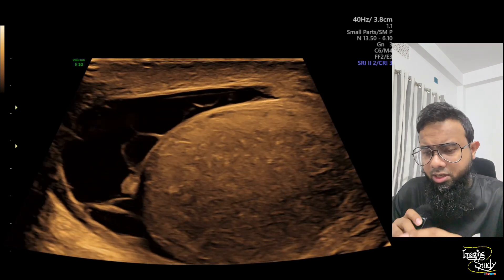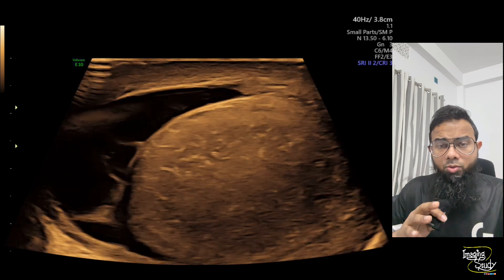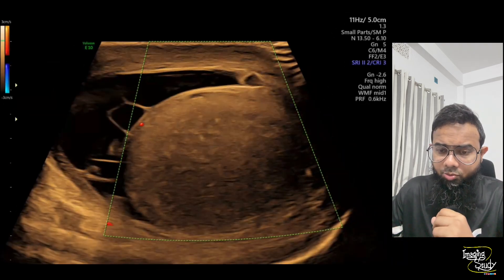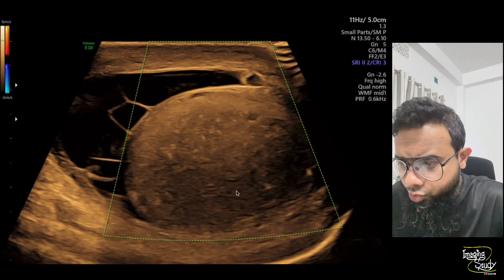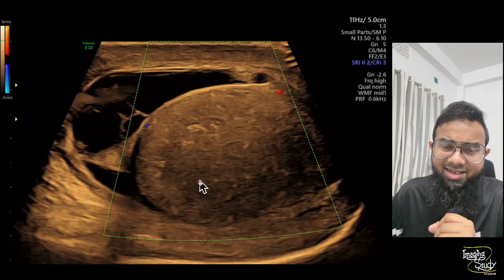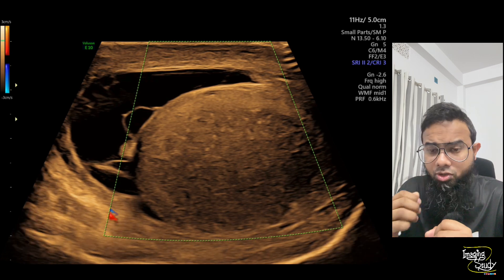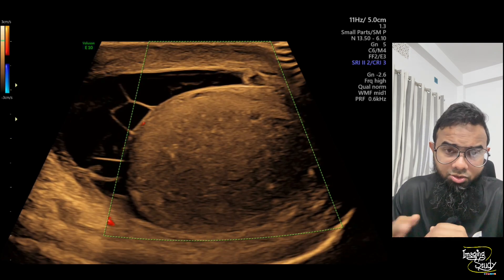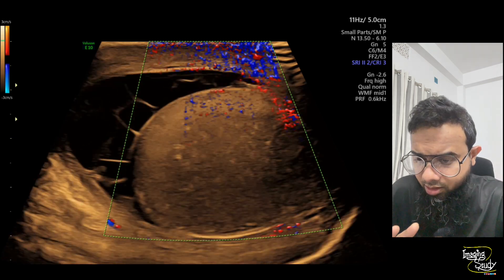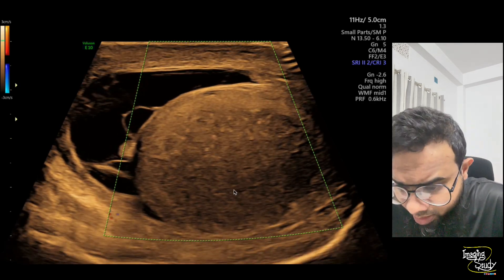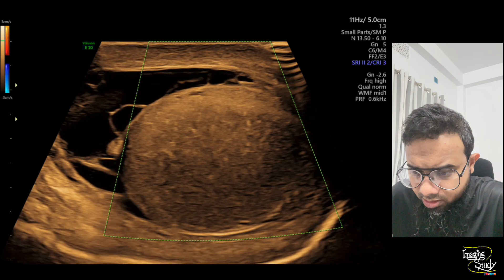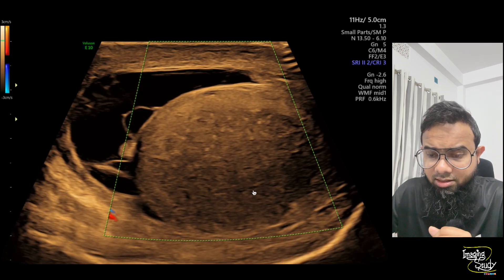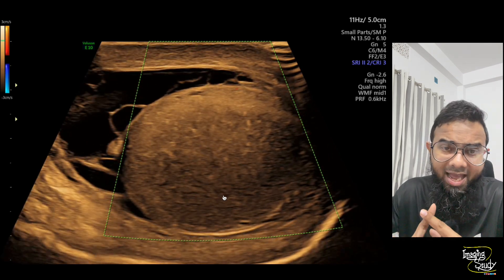We want to apply color Doppler because this appearance may be due to epididymal orchitis, orchitis, or torsion. On color Doppler with low PRF setting, there is no vascularity inside — so it's a case of testicular torsion. You can see it's completely devoid of blood flow, and there are some tiny cystic spaces visible here. These tiny areas are necrotic spaces, which are actually a feature of subacute torsion.